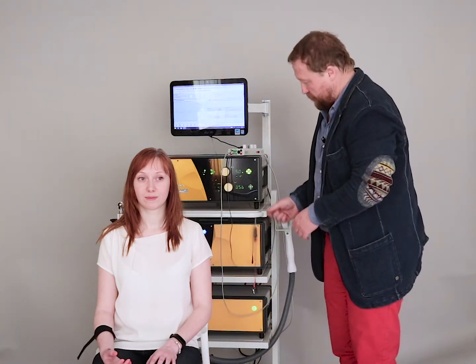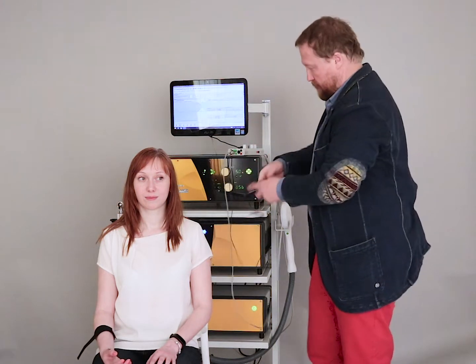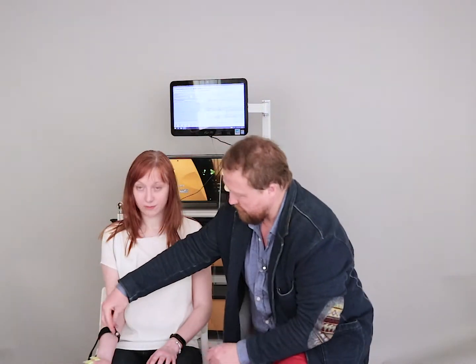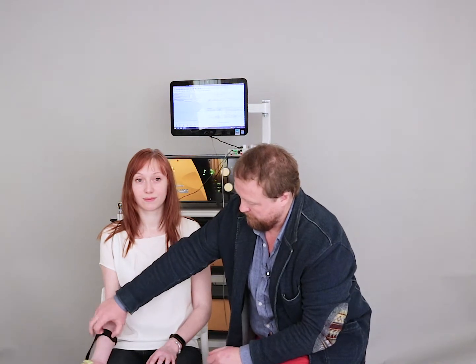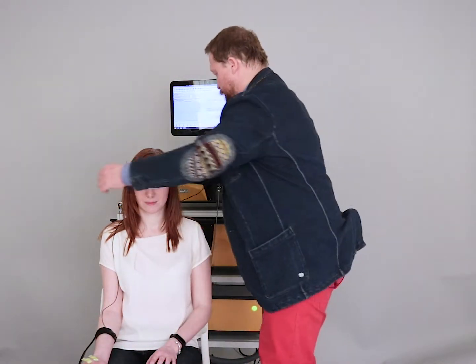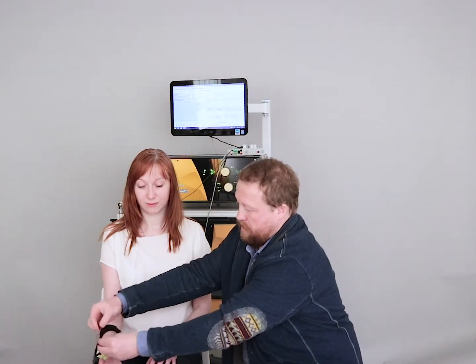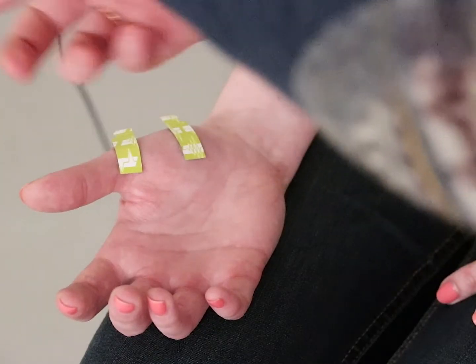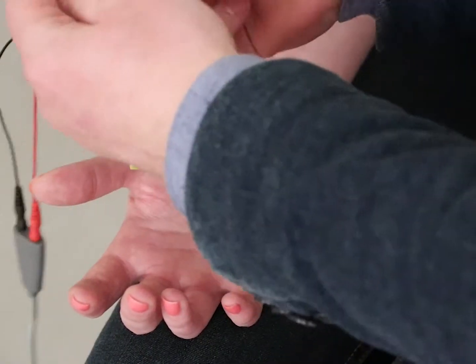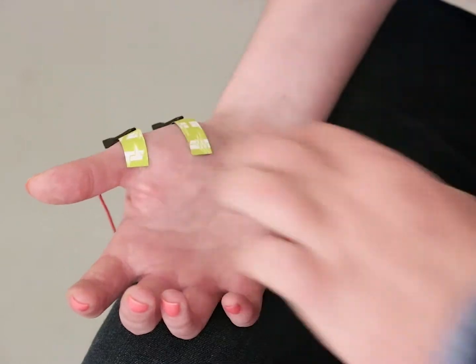I will put electrodes on the volunteer. This is a ground, this is a minus on the muscle, and plus on the tendon.